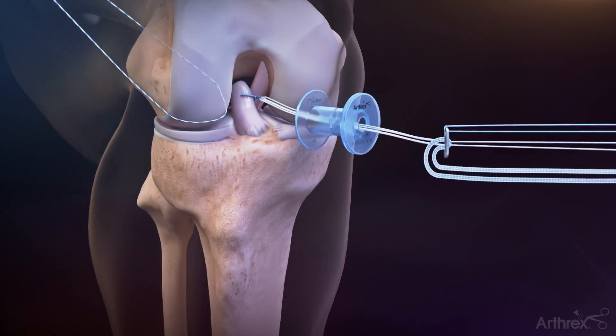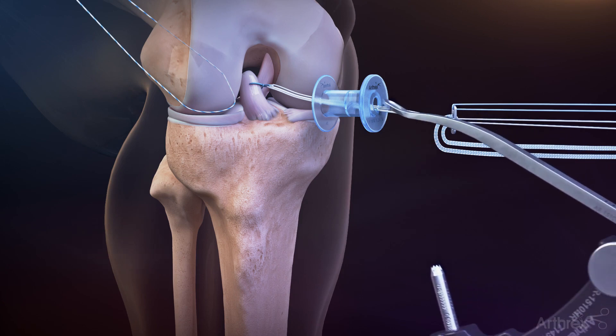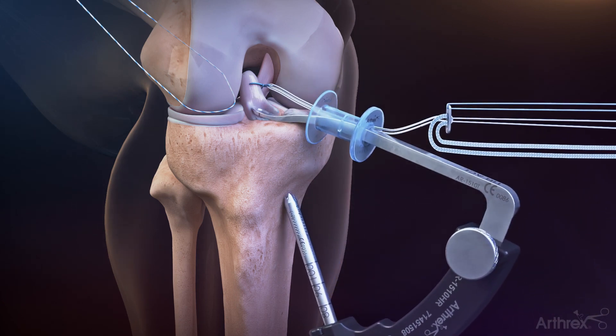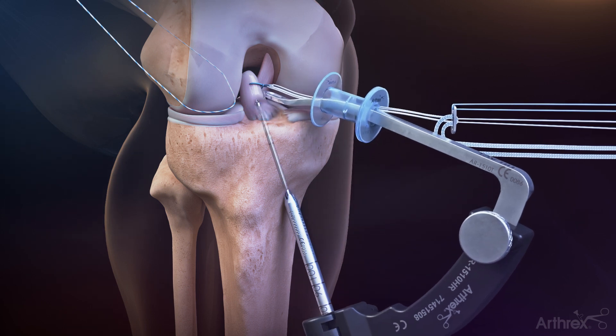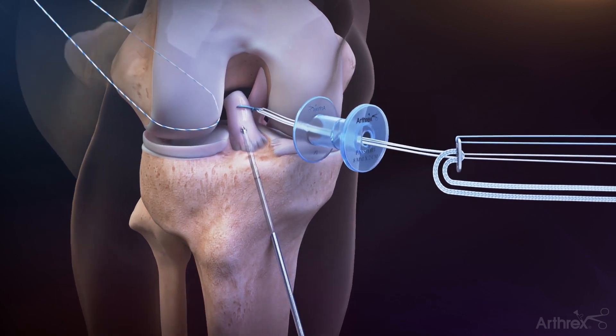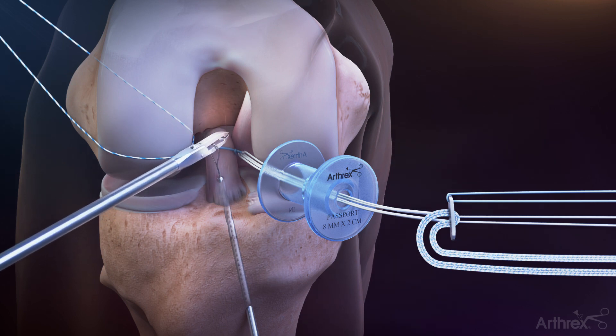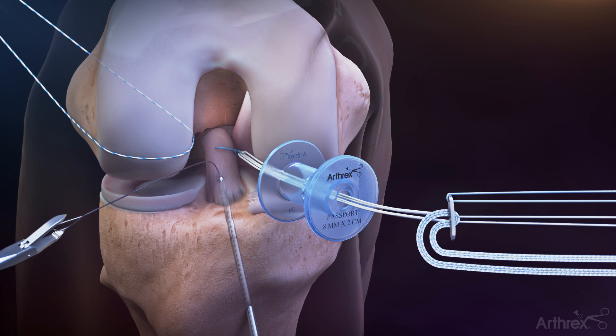Use the tibial guide with a 2.4 mm cannulated drill in the anterior third of the ACL tibial insertion. Once the cannulated drill is in position, remove the drill guide, leaving the drill pin in place. Remove the trocar from the cannulated drill and insert a lasso wire through the cannulation of the drill into the joint. Retrieve the lasso wire and carefully remove the drill pin from the tibia. Snap the ends of the wire together with a hemostat for later use.